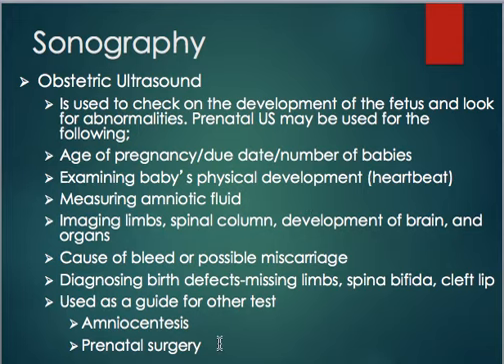There are times when surgery is performed on a fetus while it's still in the womb. So they would use that ultrasound guidance at that point to make sure that it doesn't injure the baby.